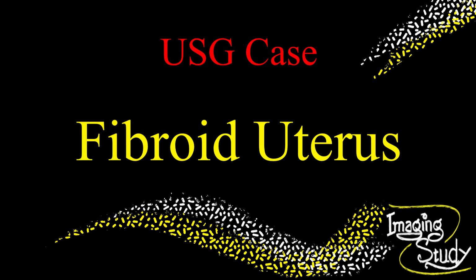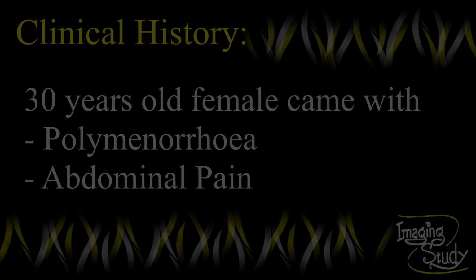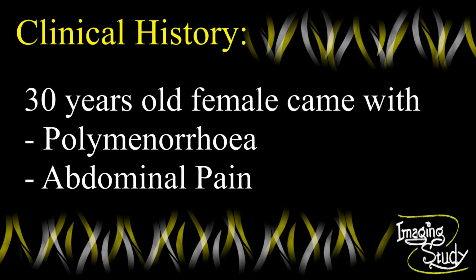Today we are going to see a case of fibroid uterus. A patient, a female around 30 years old, came with a history of pervaginal abnormal bleeding.